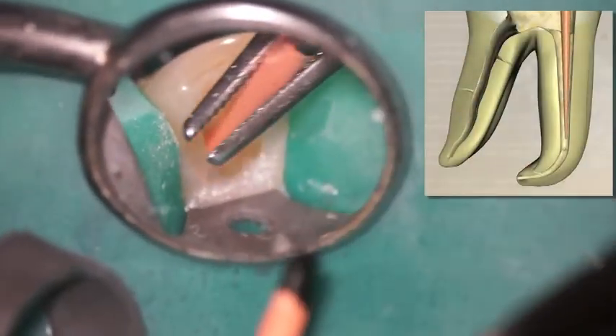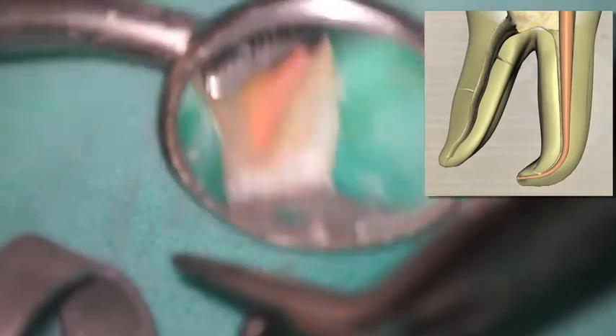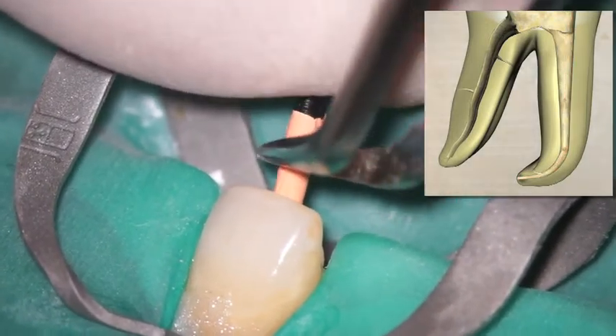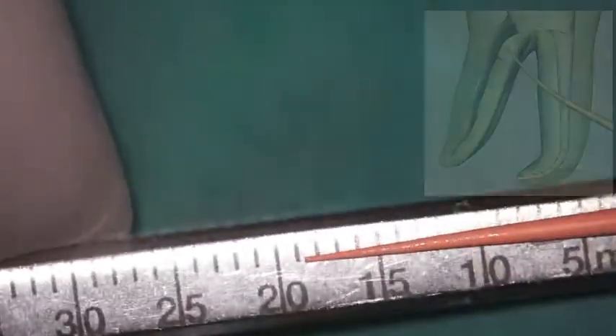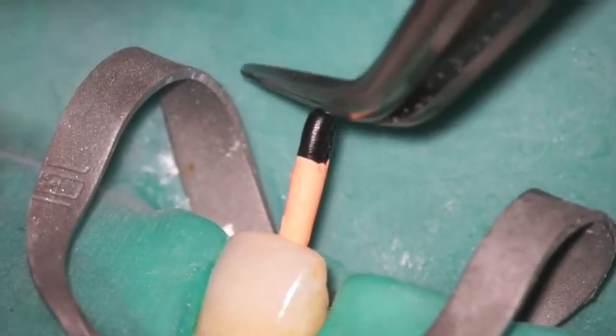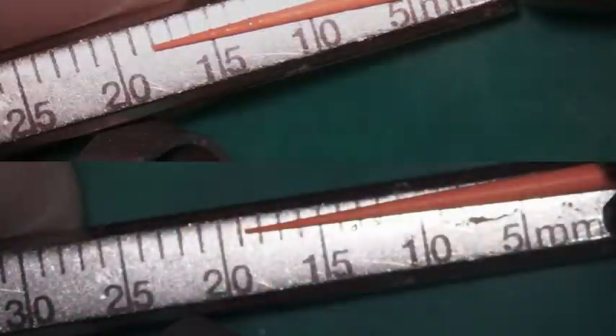Here we're fitting a gutta percha cone. Anybody that's done any significant amount of warm gutta percha realizes that based upon the size of the apical foramen and various clinical skills based on experience, it's important to take that gutta percha cone and cut it back, creating what we refer to as apical tugback. This allows us to not only gauge the size of the apical foramen, but also determine how far back we want to cut our cone, because as we heat that gutta percha and condense it vertically, it's actually going to move closer to the apical foramen.